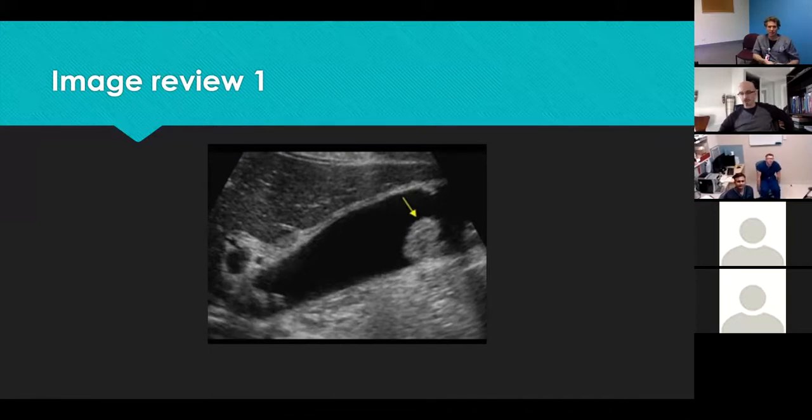I hope so. Ravi, do you want to just treat it as a pretty much viva question, as if they have shown you this image and ask you to just interpret the image? Yeah, so it looks like a focused longitudinal view of the gallbladder on a 2D image.